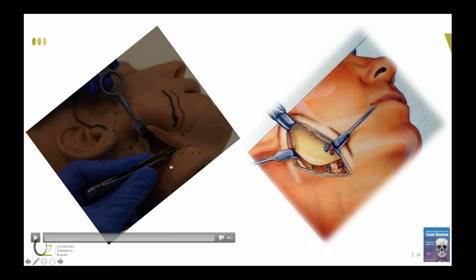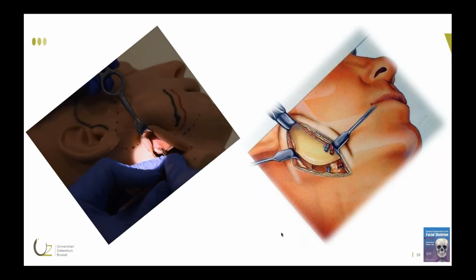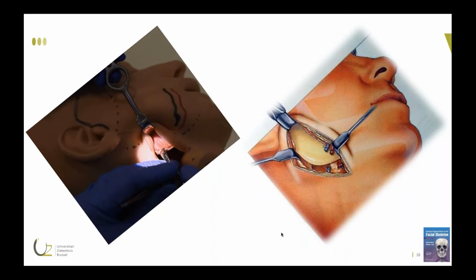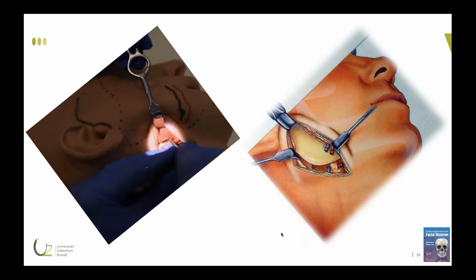The masseter muscle is not easy to disinsert. However, this should be done carefully so as not to leave any intervening soft tissue between the cutting guide and the mandibular component and the bony surface. The lateral surface of the vertical ramus should be dissected up to the joint capsule and the temporalis muscle insertion.